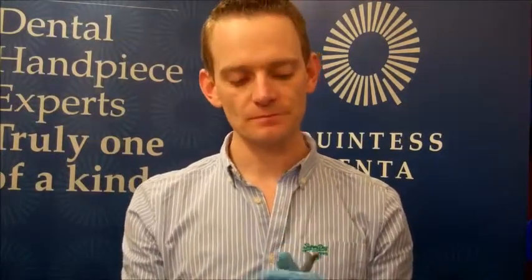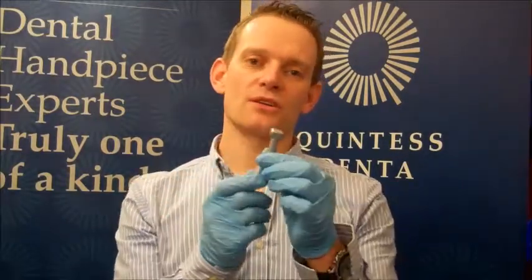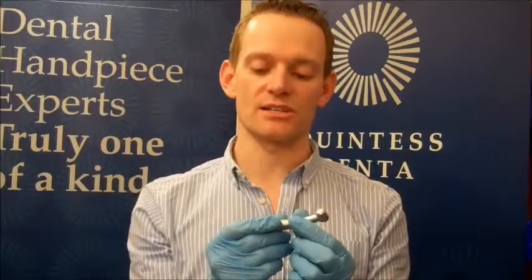Now, from time to time we can ream the head out, but if it's too badly dented, the handpiece is more or less beyond repair. Again, when you're sending the handpiece in for repair, make sure that it's individually wrapped if you're sending in more than one handpiece, because if they bang and clatter together during transit, they can become dented and badly scratched.